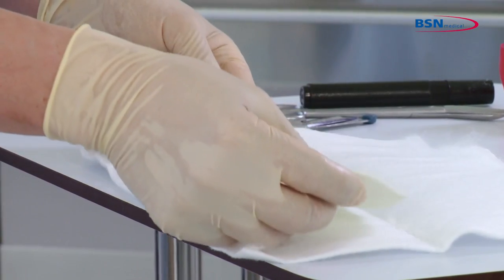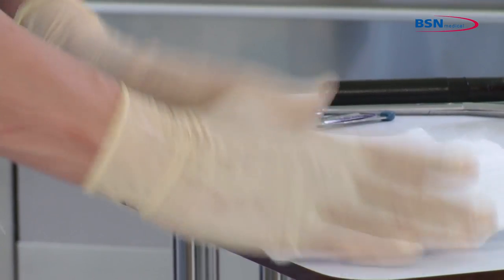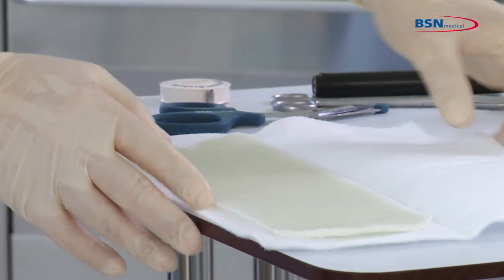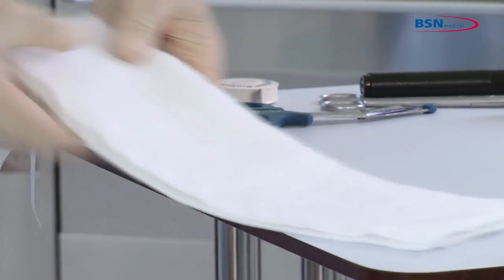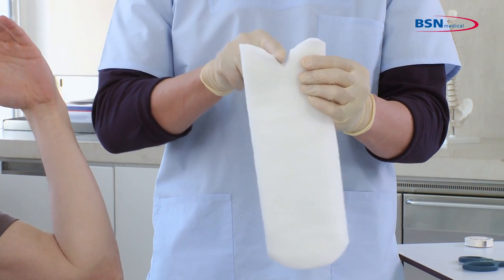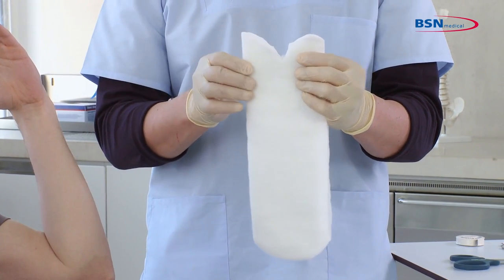Place the substrate back inside the padding and close it again. Then cut the padding in the middle following the triangle shape of the substrate gap, and leave a margin of padding on either side.